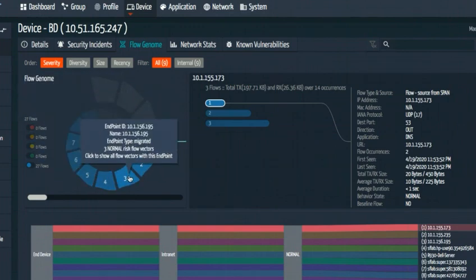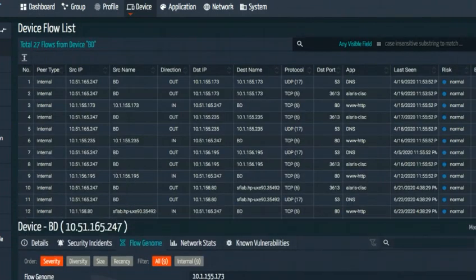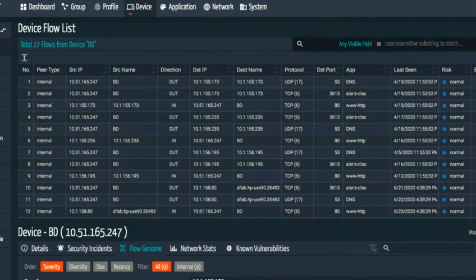But I'm going to flip around and use that information to actually develop a policy which can be enforced in the network to protect it. If we take the same information about who it's talked to and provide it in more of a rule form, which I'm showing here, you're seeing us provide a set of rules that anybody who's been doing firewall management or access control on infrastructure will be able to understand.